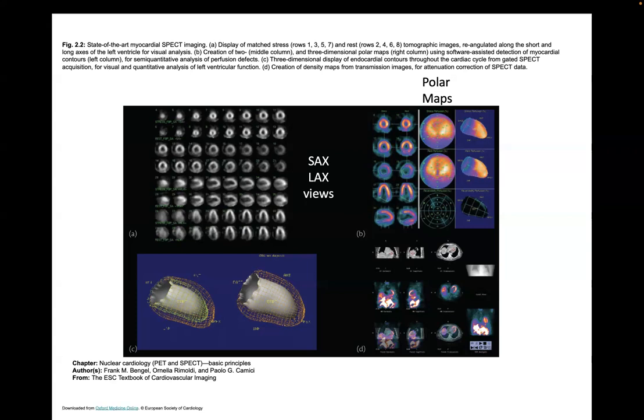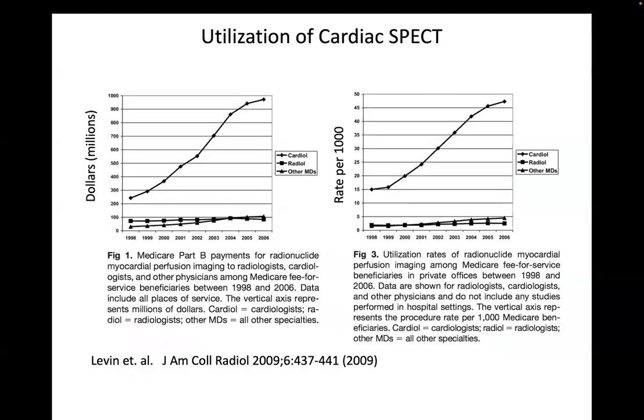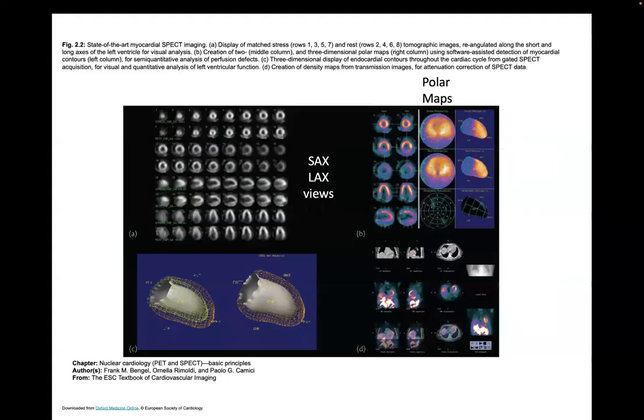Any questions about that? Now you could go read these scans. They're not that hard to read. And the other amazing thing about them, as you can see, because of their spatial resolution not being great, there's a lot of leeway in the interpretation of these scans. So that's good news and bad news. The bad news is, because there's a lot of leeway, you're going to get high variability in reads depending on who's reading it.